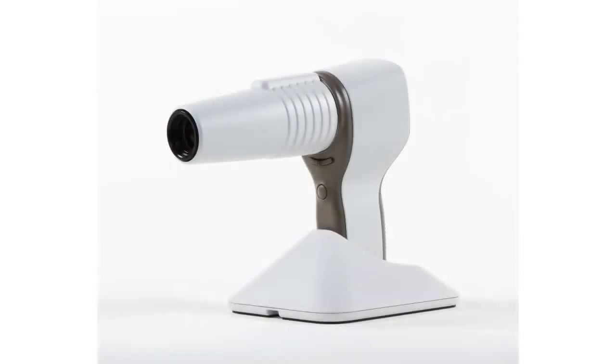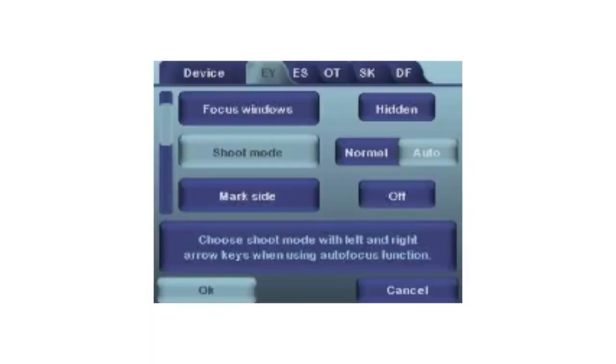We will now look at some of the other menu options. Shoot mode: With autofocus, there are two shoot modes that you can select from the EY menu: Normal and Auto.